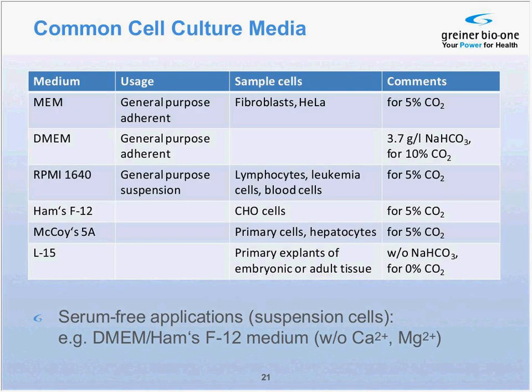Some very common cell culture media are shown in this table. Besides the modified Eagle's media, MEM and DMEM, RPMI 1640 and HAM's F12 are very common and universal media. McCoy's 5A and Leibovitz L15 are media used for primary cells. Note that the DMEM should be used with 10% CO2 and L15 with 0% CO2, actually.